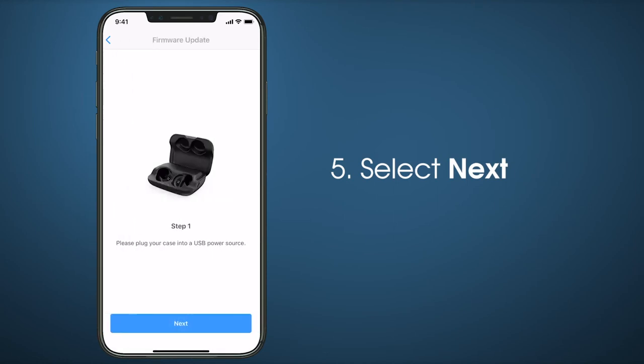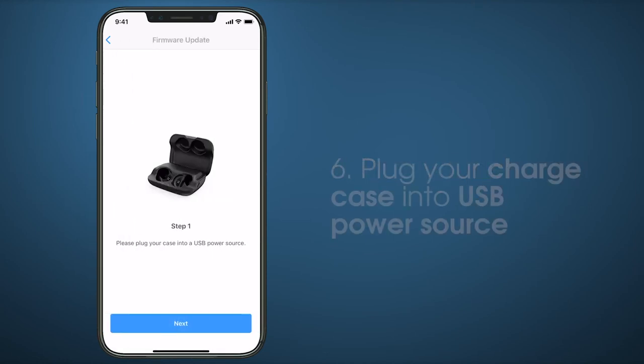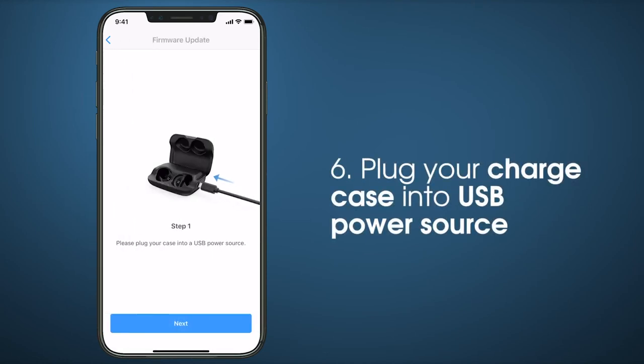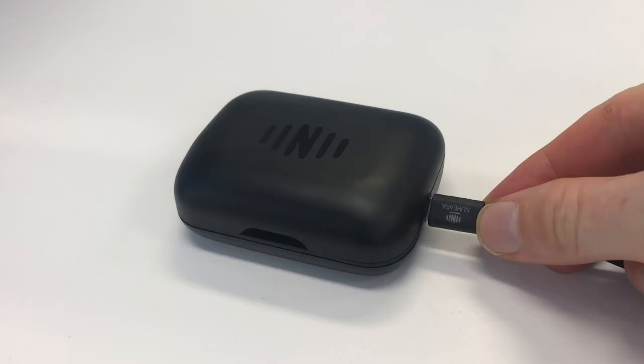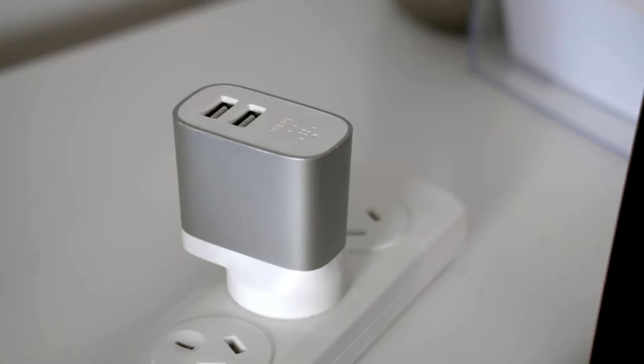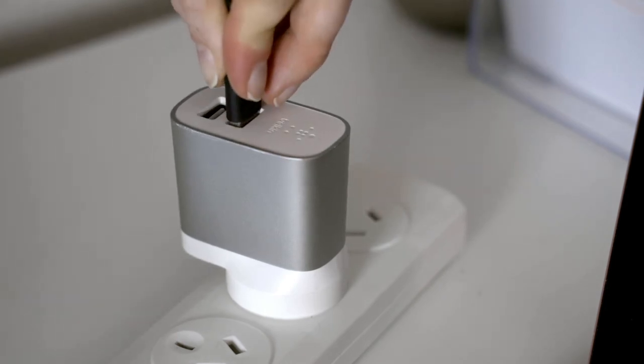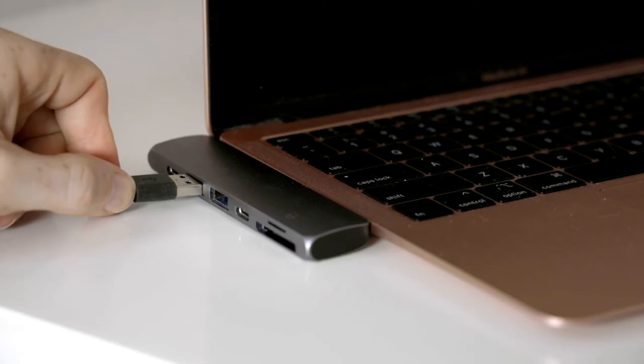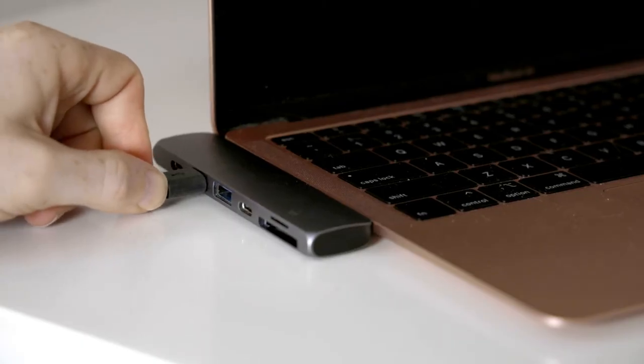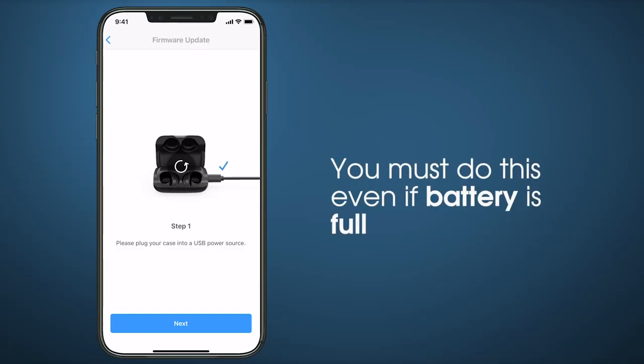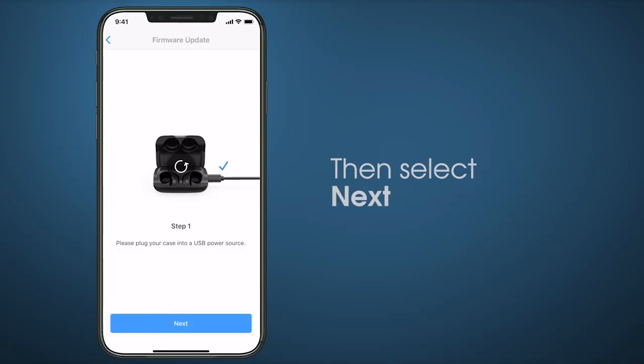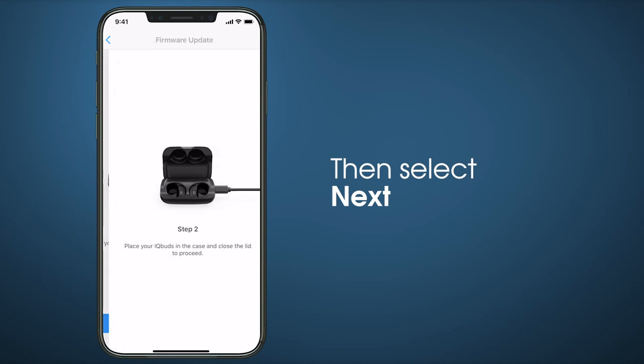Plug your charge case into the USB power source. Connect one end of your USB cable to your IQbuds case, and the other end to a power source like a USB power adapter or a USB port on a computer. You need to do this even if your charge case battery is full. Select Next.